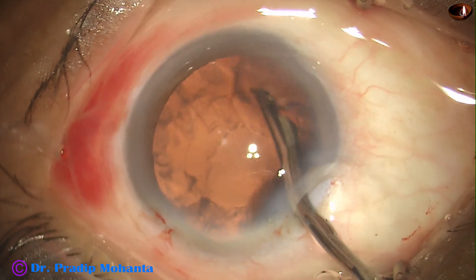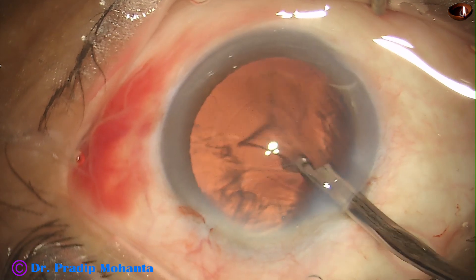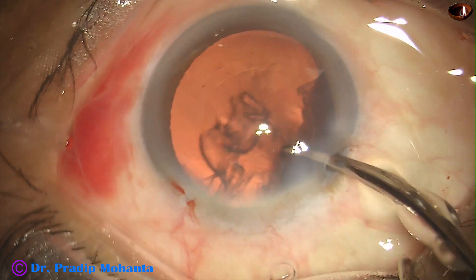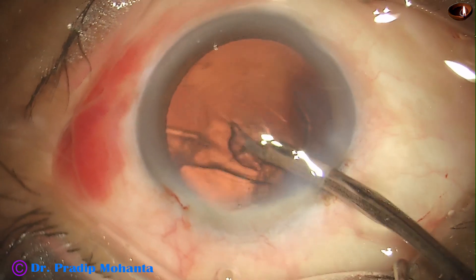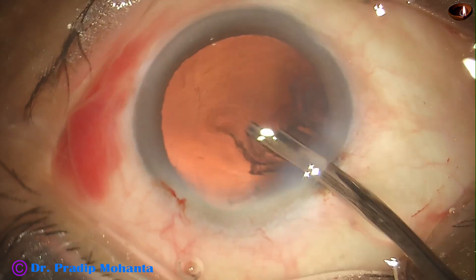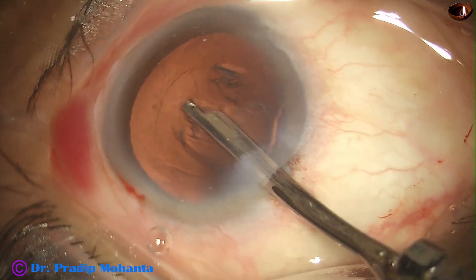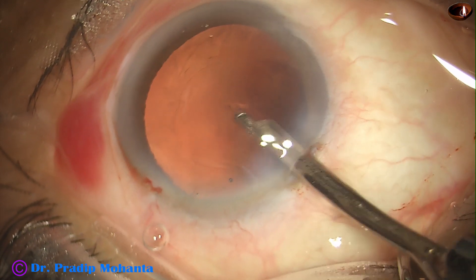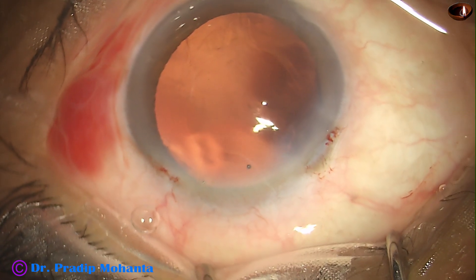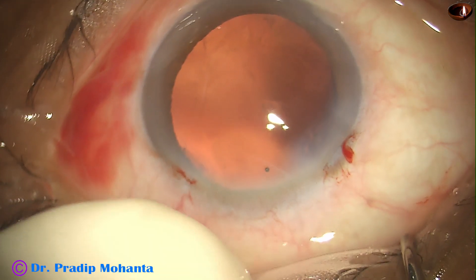Here it is. We can use bimanual irrigation-aspiration, but in this case I used a 23G Simcoe cannula. The cortical clean-up is done. I did not have to go through the side port — I could manage cortical clean-up 360 degrees through the main incision.